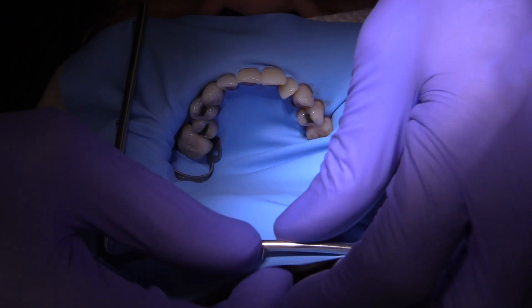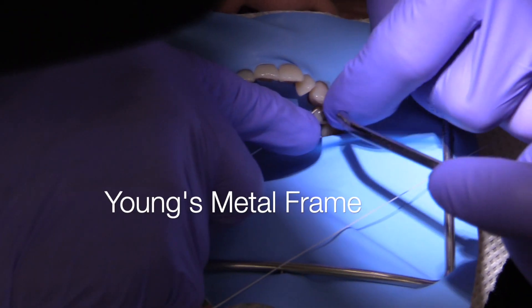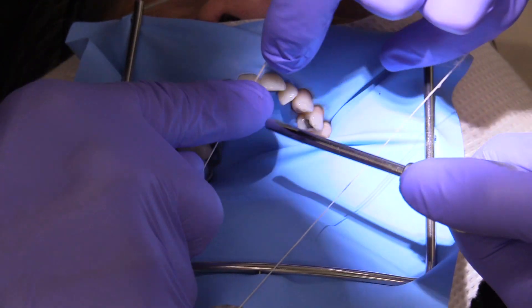Today I'm using a Young's frame and I always like the metal frames. The metal frames really hold well — they have very retentive little prongs on the corners and they're really, really helpful.